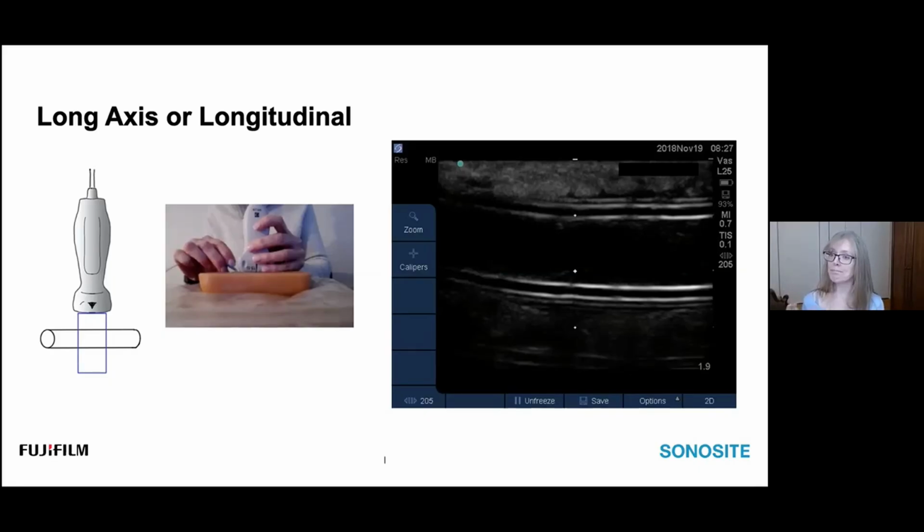On the right-hand side of this slide, you see an image of the longitudinal view of a graft. Grafts show up in a unique way: their walls appear to be double-walled. So that's how you know when you're looking at the ultrasound that you have a graft. It can help identify the type of access that you're going to be cannulating or the one that you're assessing.